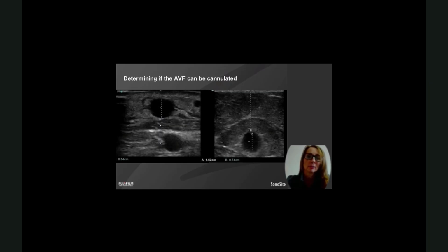Or even if it's not too deep, it's very good to have the ultrasound to guide the cannulation, because if you're off track just the littlest bits, I'll show you with my arrow, if I start at a slightly crooked angle and I insert into this vessel just on a slight angle, I'll still puncture fine. But if I start inserting here and I insert on a slightly bad angle, that angle with the fulcrum becomes wider and wider the deeper I go, and all of a sudden I've actually just cut a hole in the side of the vessel.